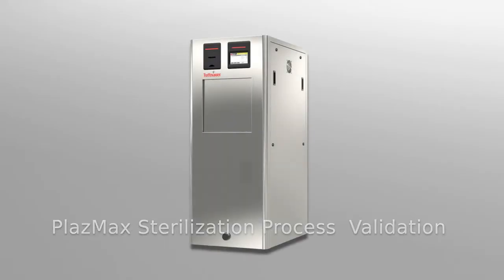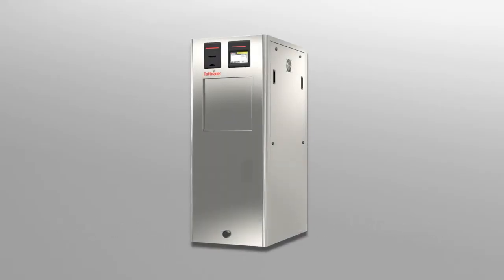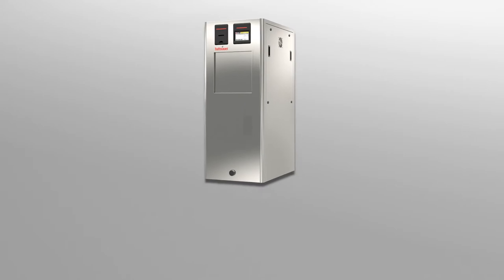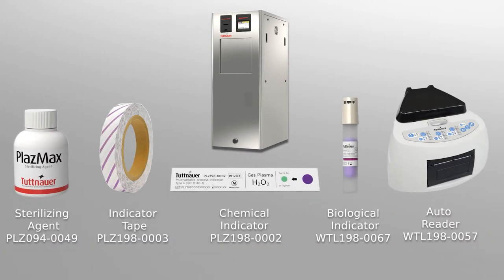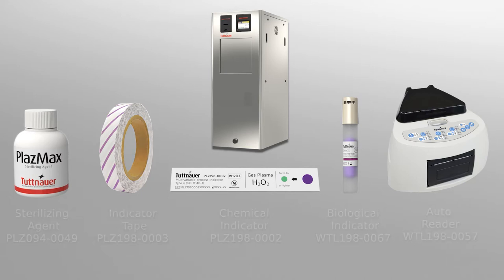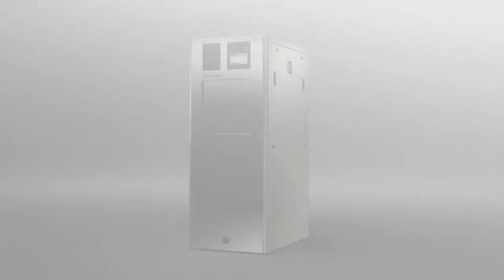Sterilization processes are of the utmost importance for ensuring your patient's health and safety and for maintaining your local standards and reputation. This video presents how to use the Tutanaurs consumables to validate the Plasmax sterilization process.